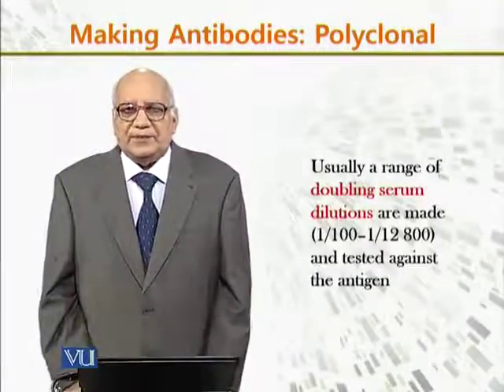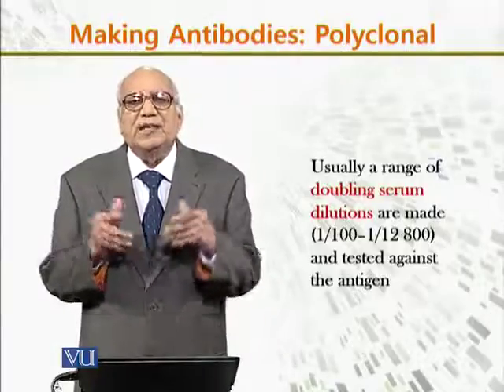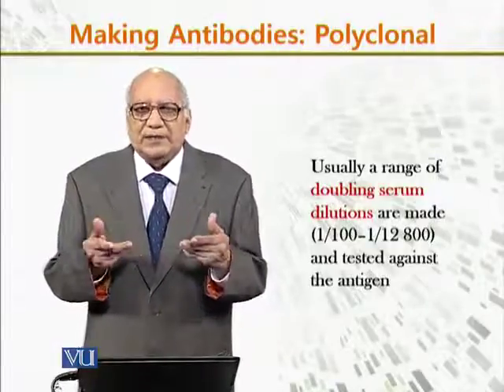Usually a range of doubling serum dilutions is used.